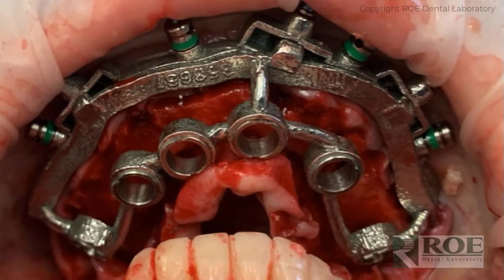In this case, there is a dual osteotomy guide process. The Nobel guided kit is used for drilling all the sites. And then the Odin guide is used for placing the implants. As you can see, there are notches here. Notch, notch. And this will correlate with the Odin kit for rotating the implants in the right index, because there are angled implants. You can see, especially in the posterior, angled implants. So we have to get the indexing rotation of the implants perfect so that the temporary cylinders are straight up and down for the prosthetic.